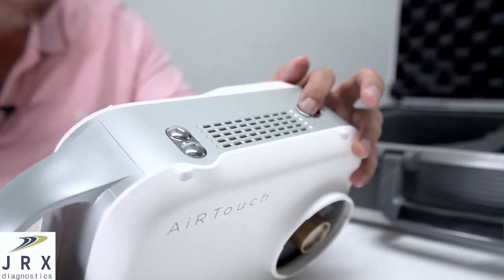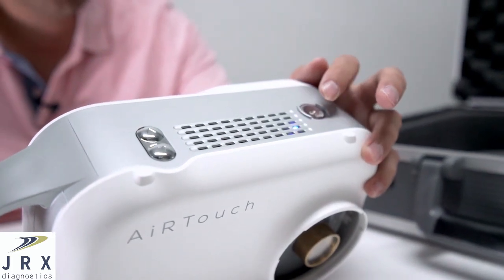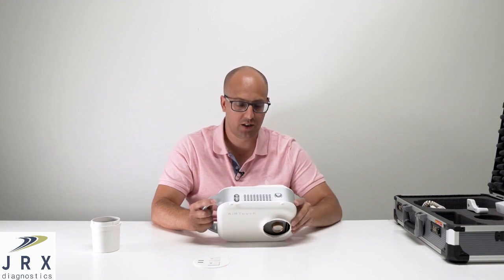Up at the top you'll see we have two sets of buttons. This one is for power for the system, and these two buttons are to change your technique up and down if you don't want to do it from the touchscreen application.